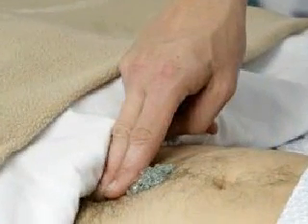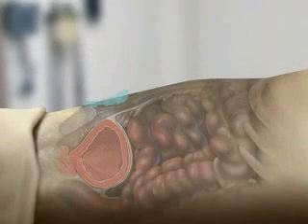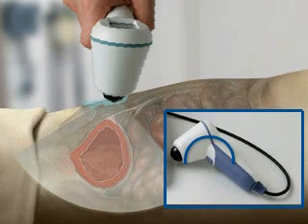Start with the patient in the supine position. Palpate the patient's pubic bone and place an ample quantity of gel midline on the patient's abdomen, about 1 inch or 3 centimeters above the pubic bone. Standing at the patient's right side, place the probe on the gel and aim toward the expected location of the bladder. For most patients, this means angling the probe slightly toward the patient's coccyx, or tailbone, so the scan clears the pubic bone. Press and release the scan button, located on the underside of the probe.